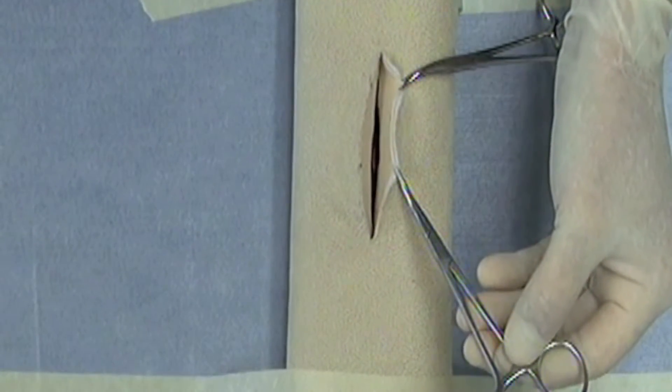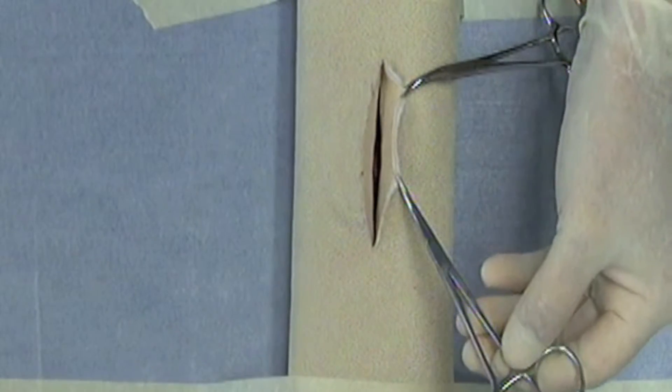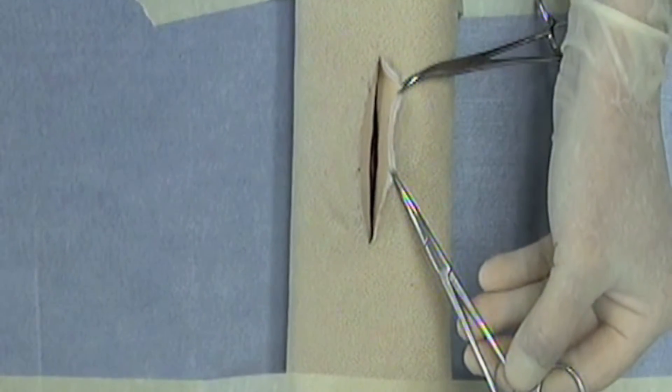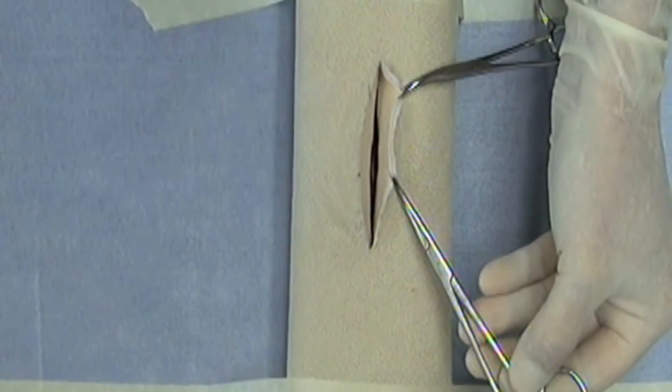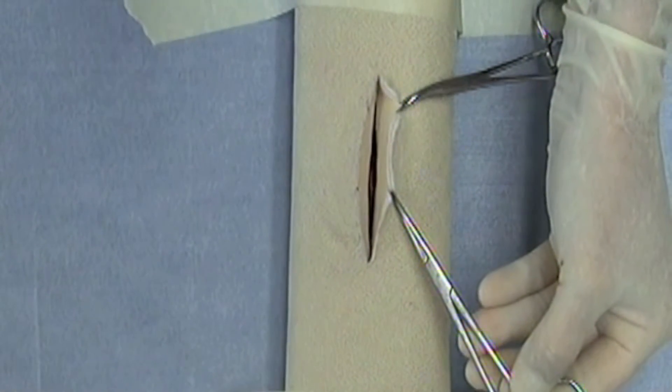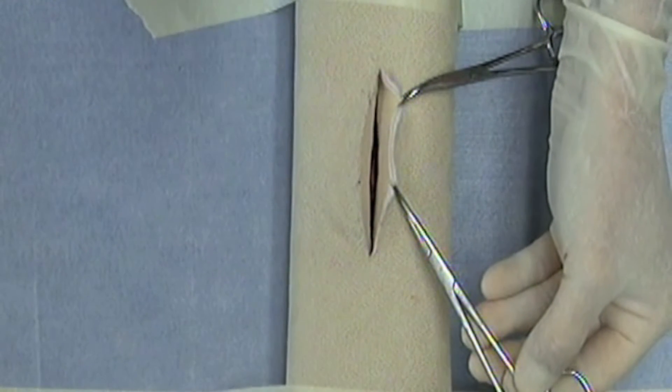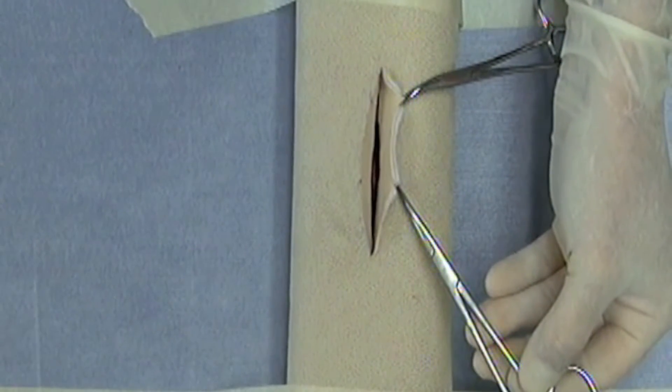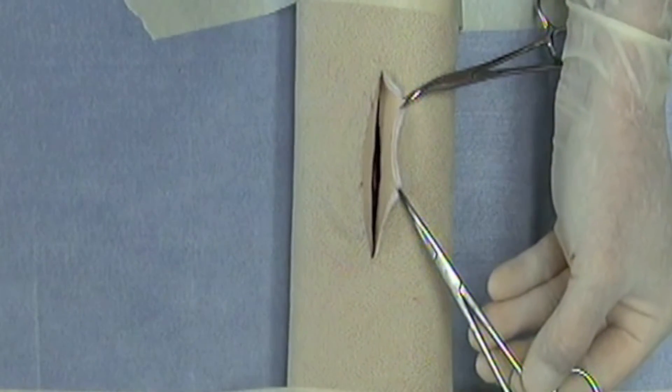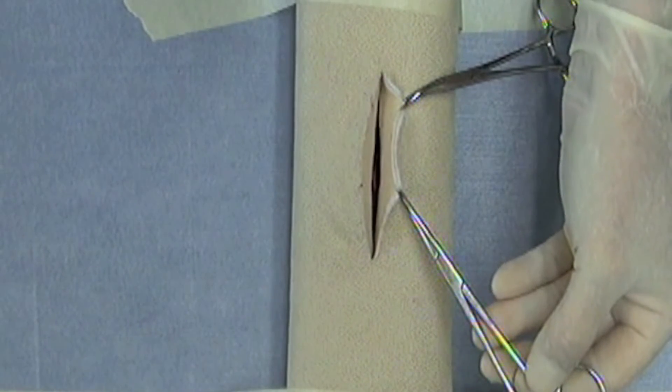You'll often times hear surgeons say tips up, tips up, meaning that you want the tip up in order to allow you to see and to make sure that you can clearly see that your suture is underneath the tips of the instrument and also obviously if it's underneath the tips of the instrument, it will be completely encircling the involved vessel.